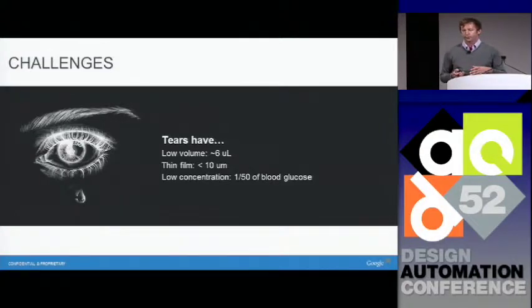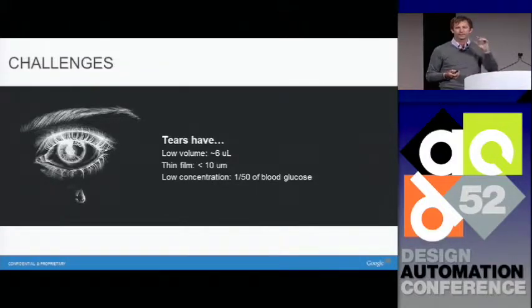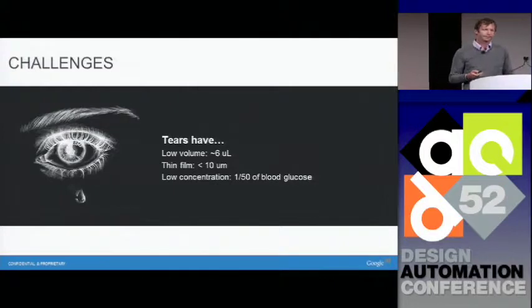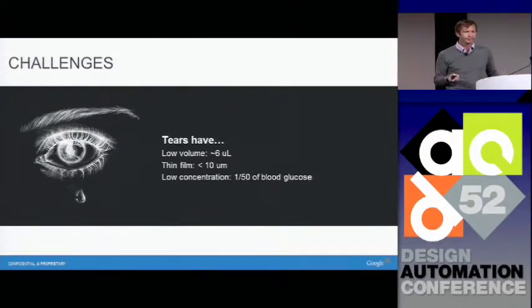On top of that, of course, as all of you know, the eye is extremely sensitive. It's sensitive to dust. It's sensitive, if any of you wear contact lenses, to imperfections in the contact lens, eyelashes. The device has to be extremely soft, supple, and comfortable to wear if it's going to be tolerable. And again, the goal here, this is not something that can be a burden. This has to be something that you would naturally wear. You don't even know it's there.